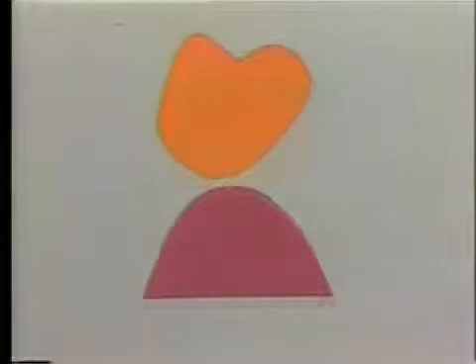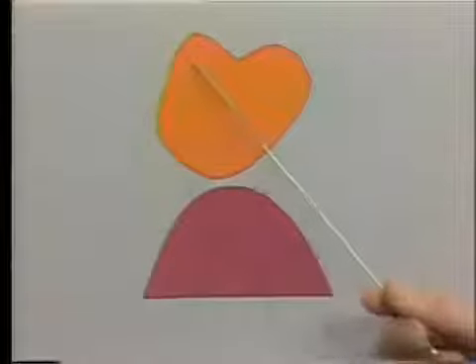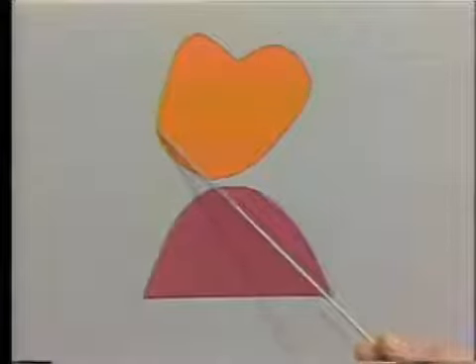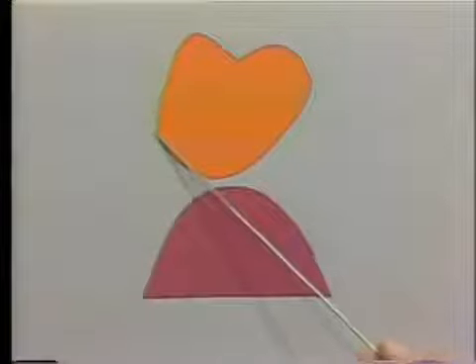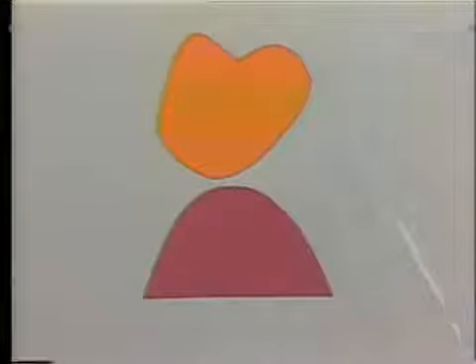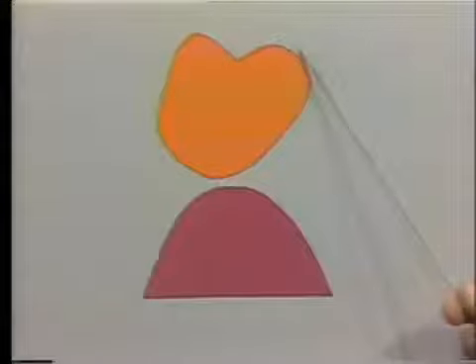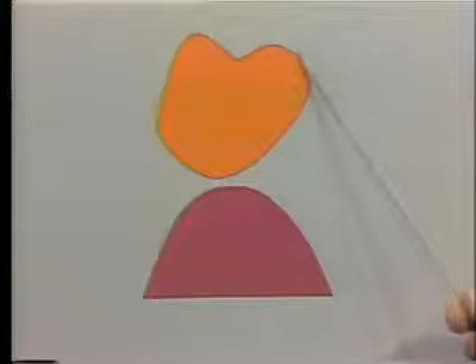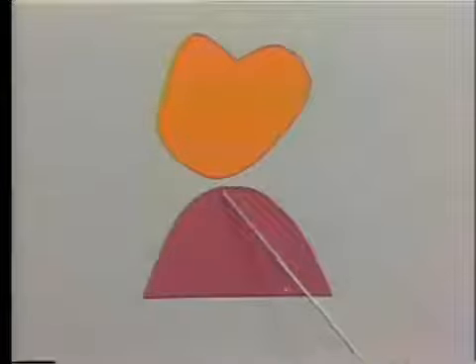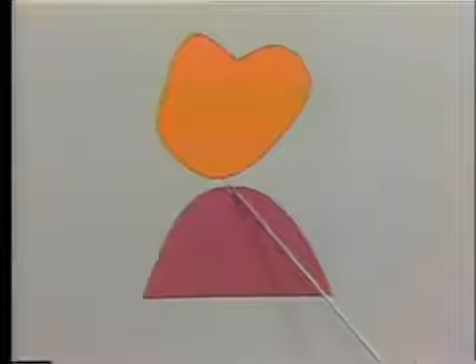in which the Pontic form has been developed as is shown here. I think you can recognize that on the buccal surface here, the occlusal two thirds are left more or less the same as the natural tooth, and then the surface swings in to a point here just opposite to the crest of the alveolus. On the lingual surface, where aesthetics are not at all important, the change takes place at about the junction of the occlusal and middle third of the tooth, and the lingual surface of the Pontic is swung right in to meet the other above the crest of the alveolus in this situation here.